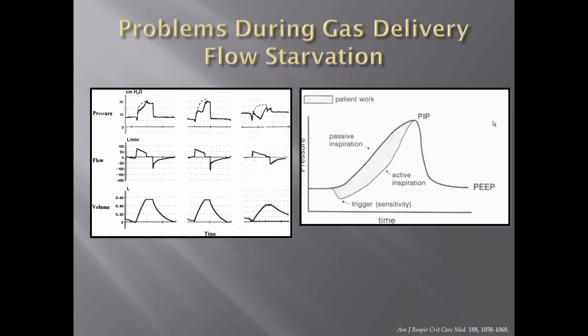So yeah, this patient had really severe flow starvation. Often what we say, this is like a more normal breath. And then this scooped out area here is what we commonly see in flow starvation. And this area in between is what is often called patient effort. And it can look like this, very subtle, or it can be more so, like what I saw with our patient, where it's almost completely negative. We're not negative here, but it's in the wrong direction.